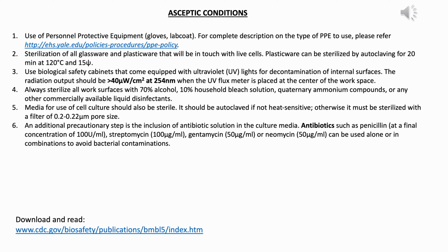A very important thing is that one has to look at the cells every day. When you are culturing the cells, you have to check for three things. One, whether there is any cloudiness or turbidity in your culture media. If there is turbidity, that means there is some kind of contamination happening. Two, most media contain phenol red, which we normally buy media with, and which is an indicator for pH. If there is any contamination, the media will turn yellow. So that again is your indication. The media should always be in its original red color.